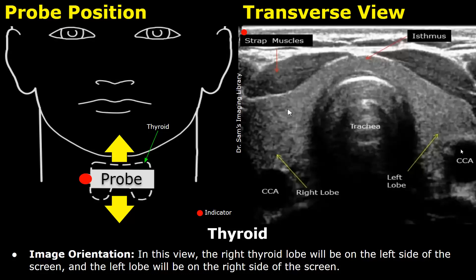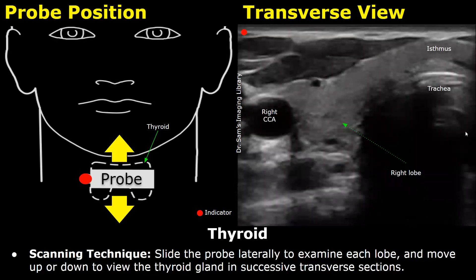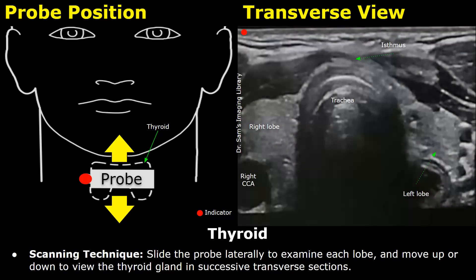These two anechoic round structures are the common carotid arteries. Slide the probe laterally to examine each lobe and move up or down to view the thyroid gland in successive transverse sections. It is important to move the probe up and down to completely scan the thyroid gland and to evaluate each lobe individually.